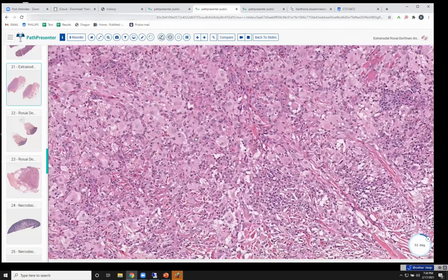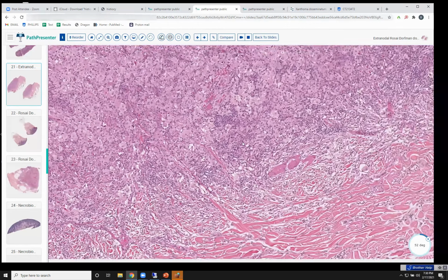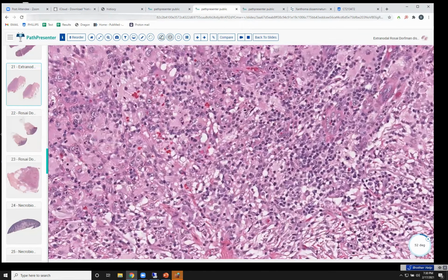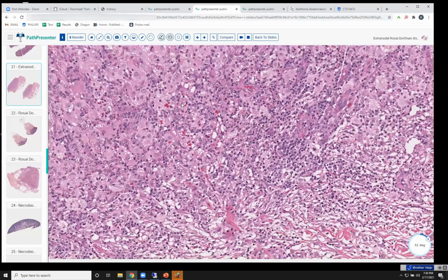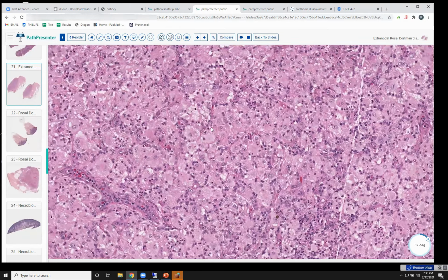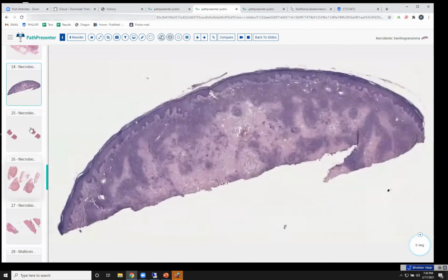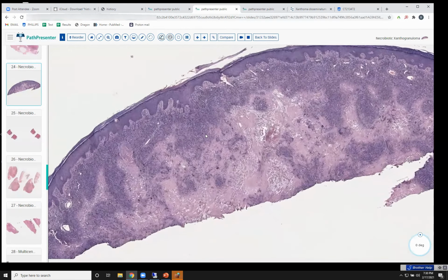And then in the darker areas, which are over here, we're seeing some of them, you can see it's a dense lymphoid infiltrate. So this is a fairly characteristic picture of Rosai-Dorfman. The next under the same group, which is the mucocutaneous, cutaneous, non-xanthogranulomatous, is this one, which is also fairly characteristic.